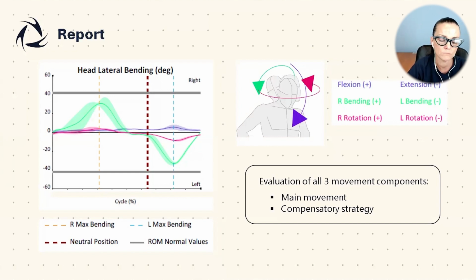If the patient doesn't manifest any motor limitation and doesn't feel pain in performing the movement, of course, the curve should arrive at least at, or exceed, this limit of normal range.